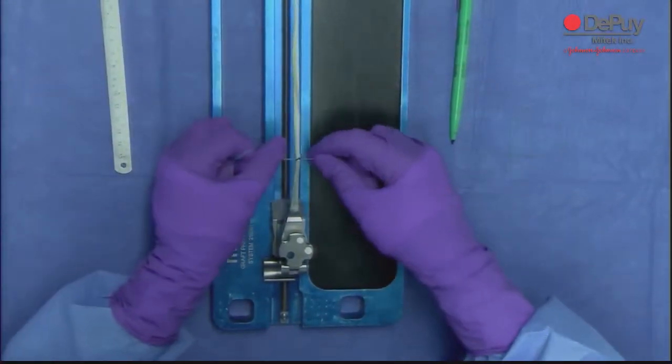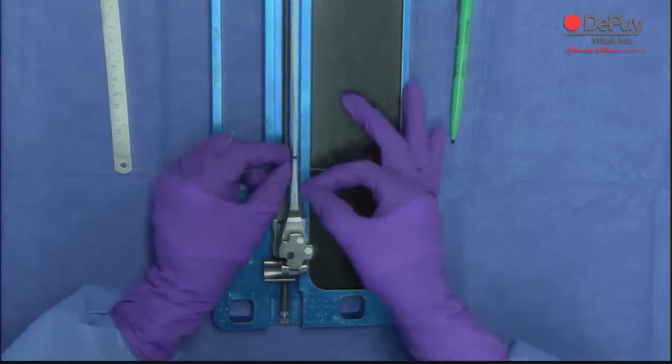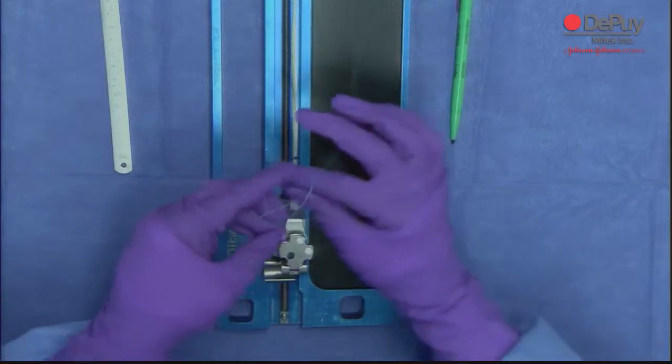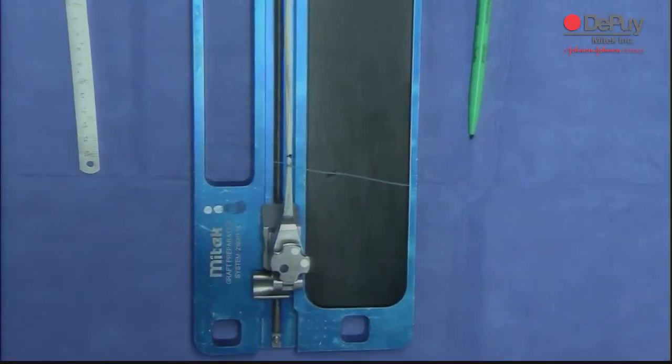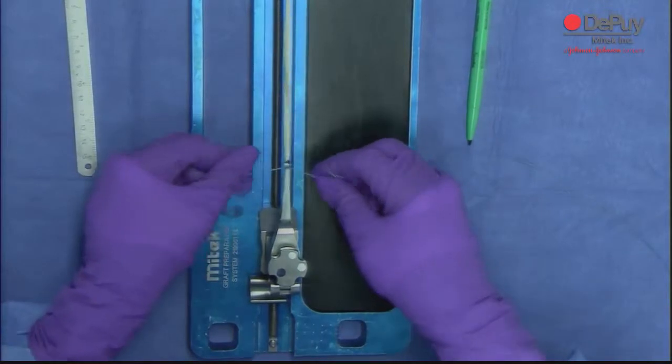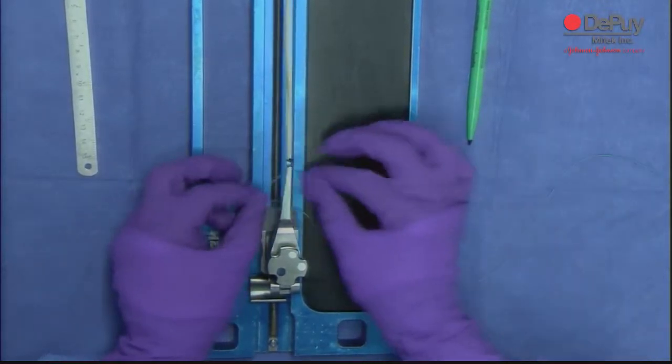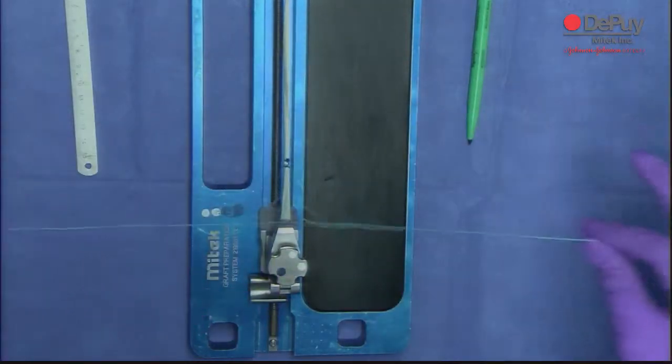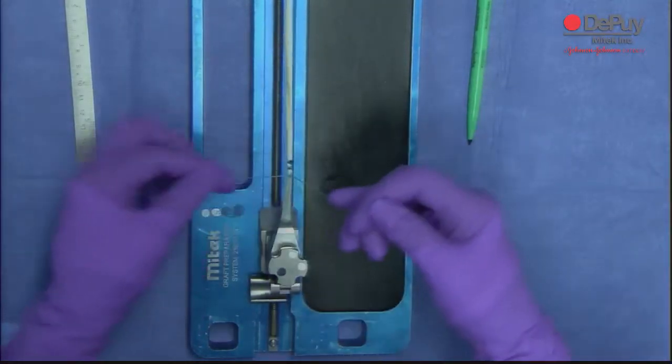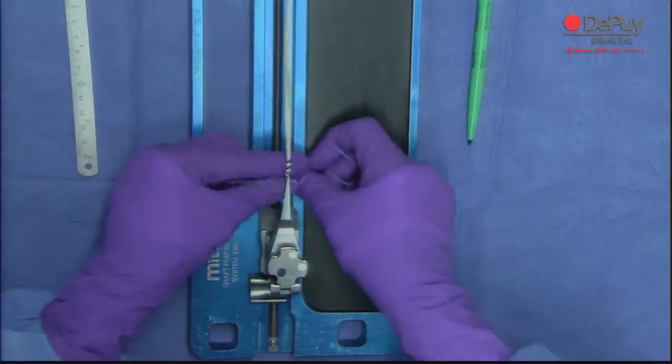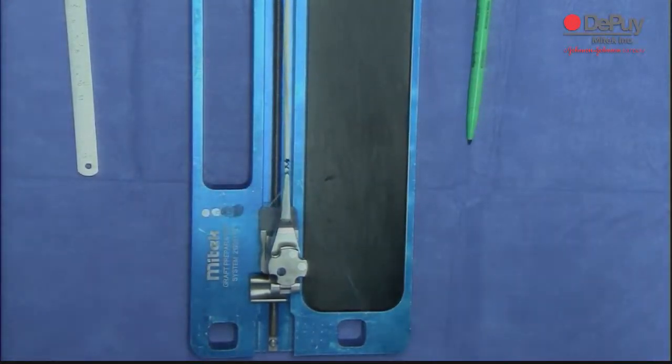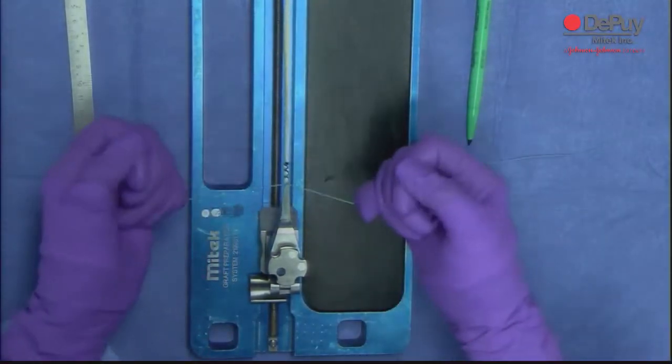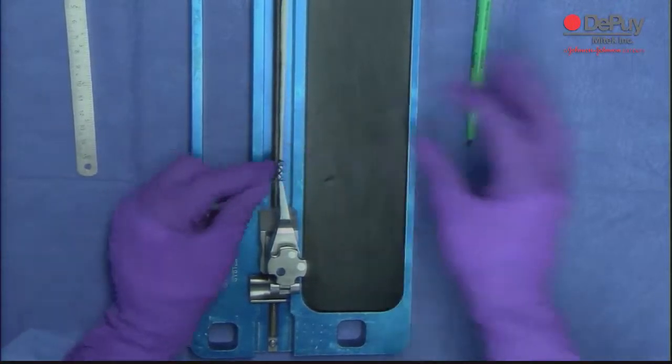This works particularly well on this very tiny end of the graft where it's very hard to put a needle in without shredding the tendon. This finger trap tensioning suturing technique is much better. This was studied in Taiwan. They did a write-up in the May Arthroscopy Journal, and you can find the study that tested it for strength.